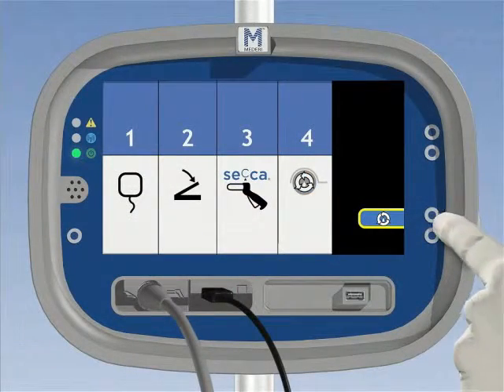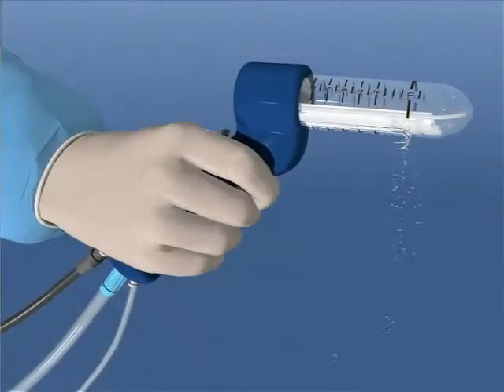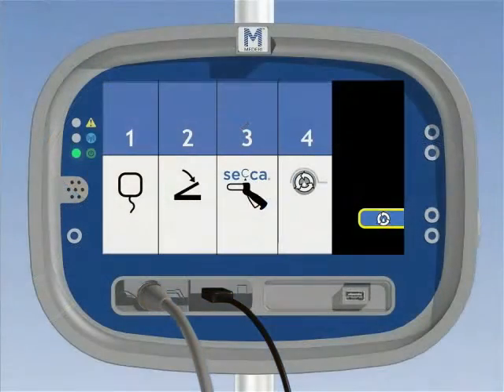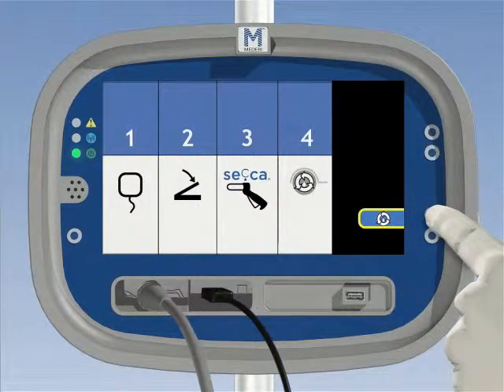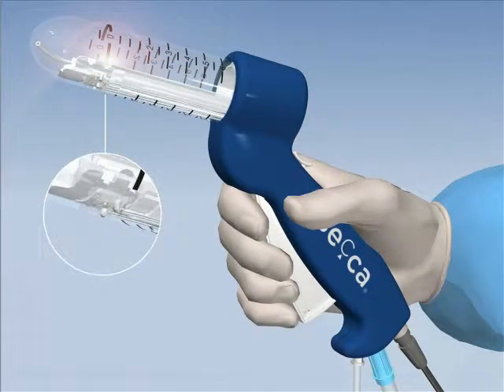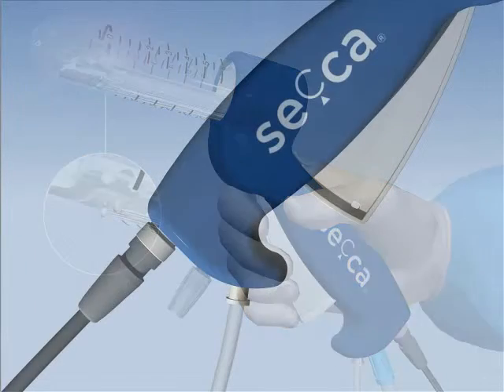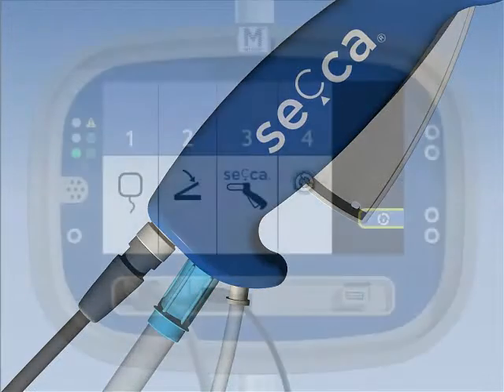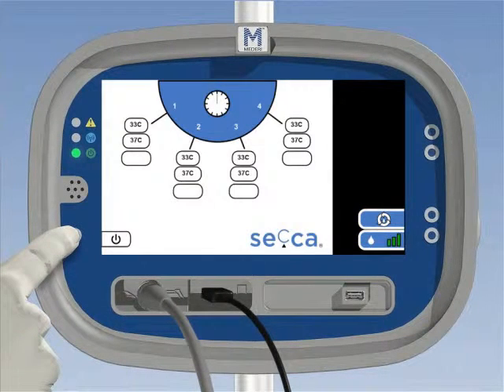Push the prime button on the lower right of the generator to initiate priming of the Seica handpiece. Inspect irrigation exit ports and ensure water flows through the device near the base of each needle. Push the prime button again to stop the prime cycle. Then retract the needles by pressing the thumb-controlled needle release button. Set the wall suction to 100 to 160, but wait to connect suction to the handpiece until after insertion into the rectum. Always make sure the needles are retracted before insertion into the patient and before moving the Seica handpiece during the procedure. Push the power on mode button to advance to the standby mode. Note that the generator will not allow progression to standby mode without priming first.